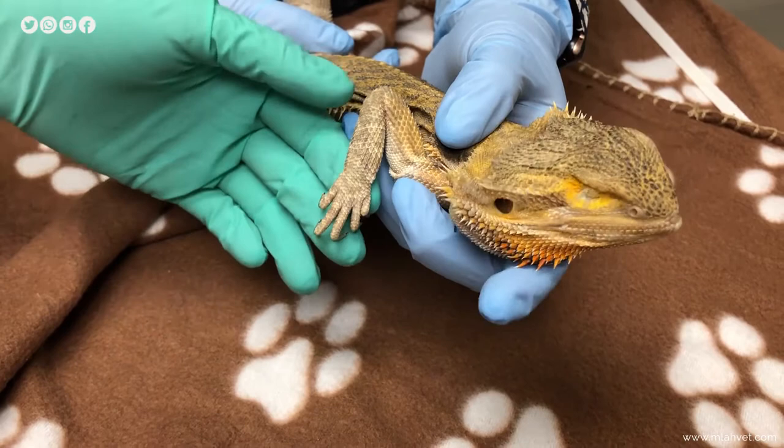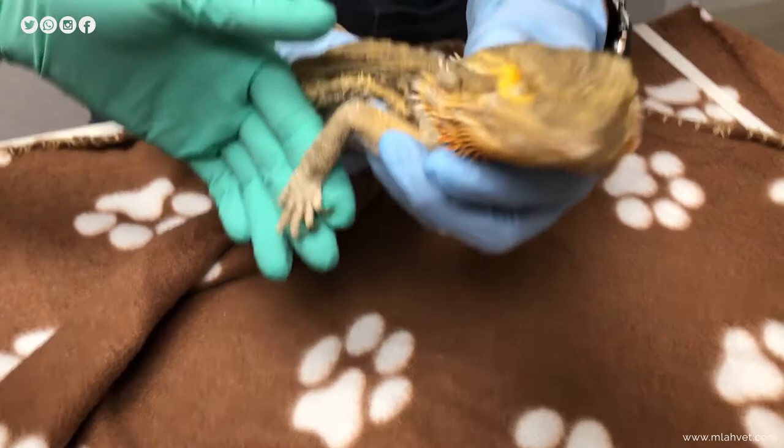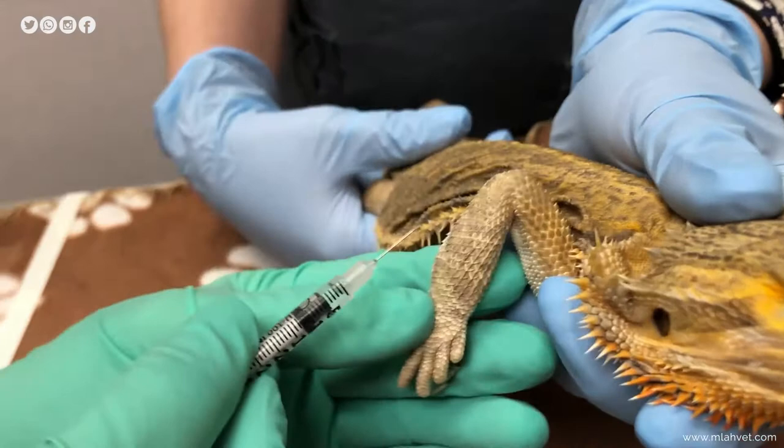If you have another person to hold your patient while you give the injection, that is definitely helpful — this is a two-person activity if possible. You're going to look at the scales and make sure that you are going between the scales, because it's uncomfortable otherwise.